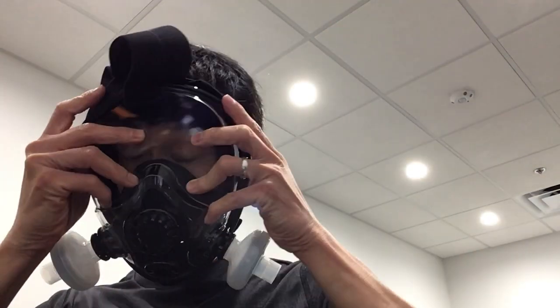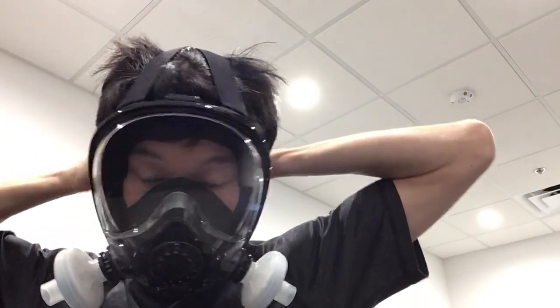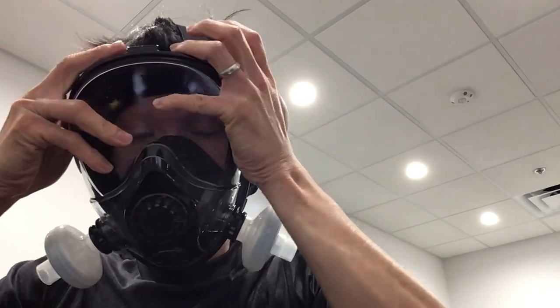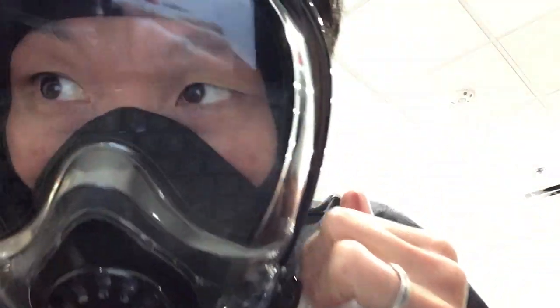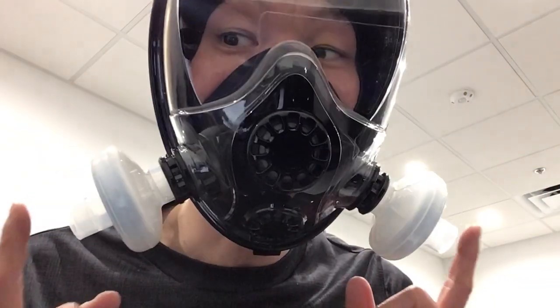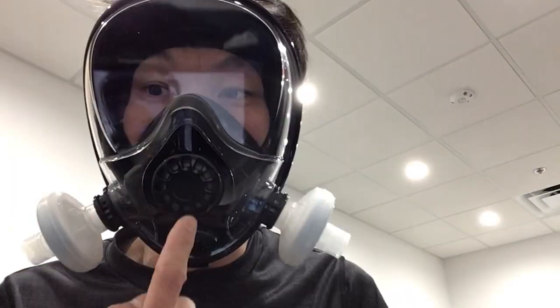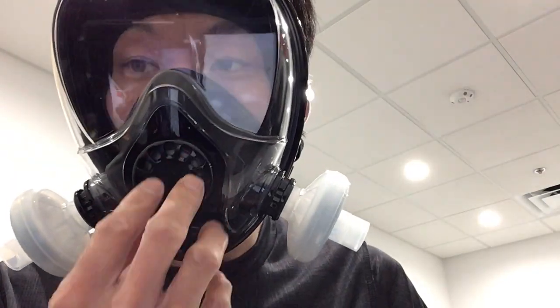I'll show you the fit. No leak — it's a great fit. It's filtering both inspiratory and expiratory because I took the one-way valves out. I do need to cap this one-way valve to make sure that it doesn't allow you to expire air out.